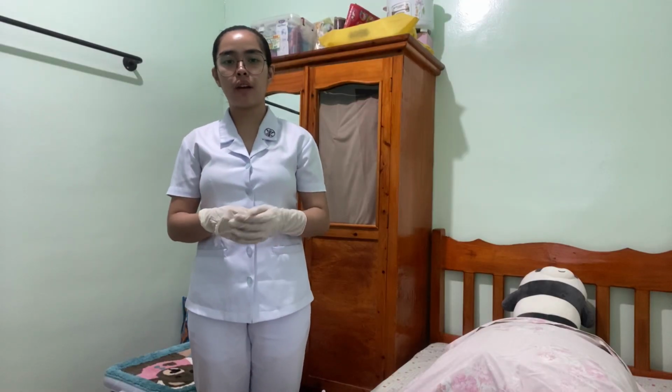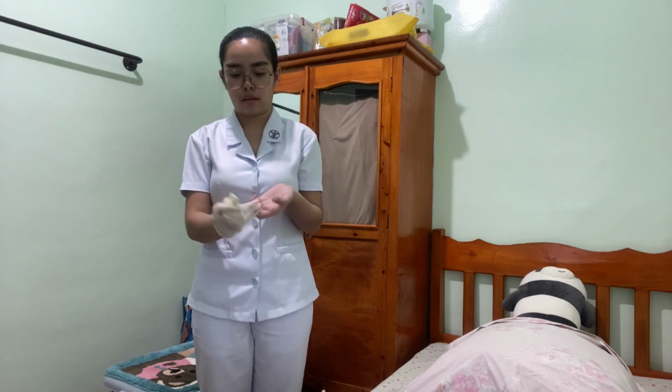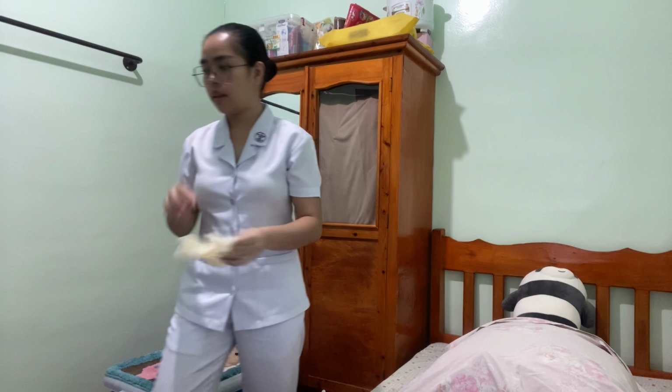So after that, we have to remove the sterile gloves and discard. So after doing this procedure, we have to perform the aftercare of the equipment used, perform hand washing, and also document the procedure done.